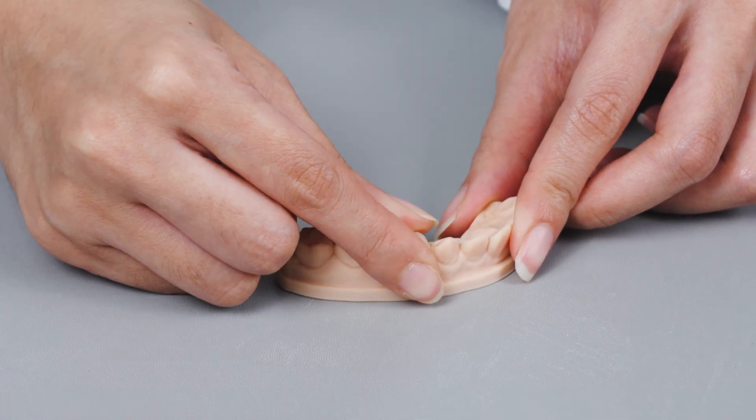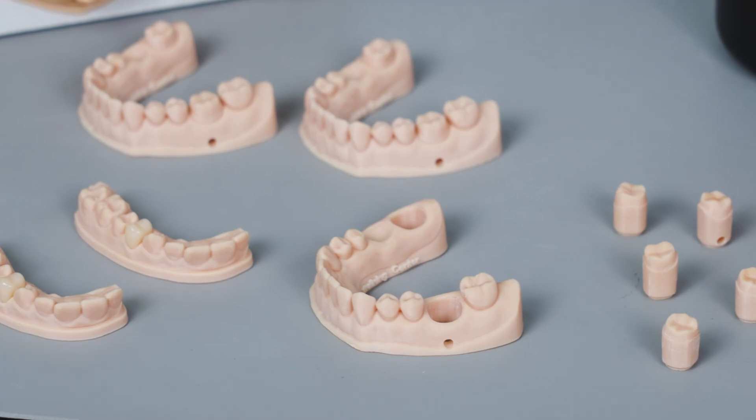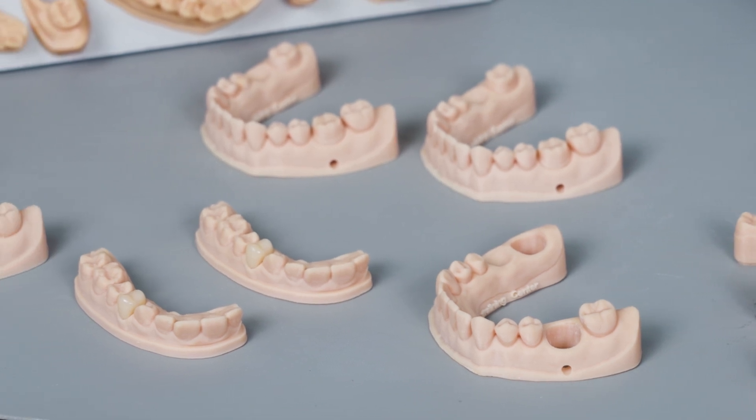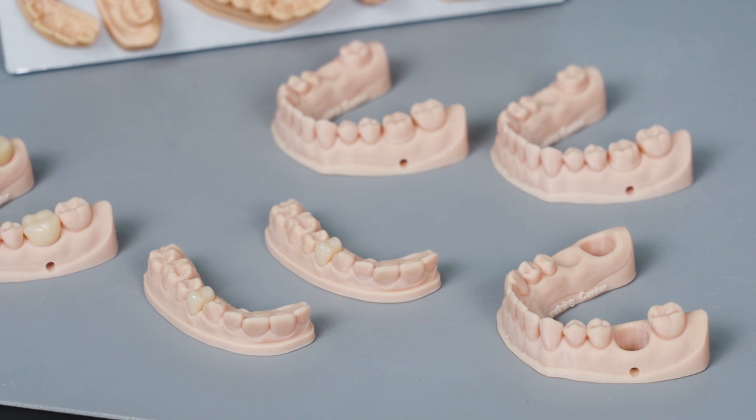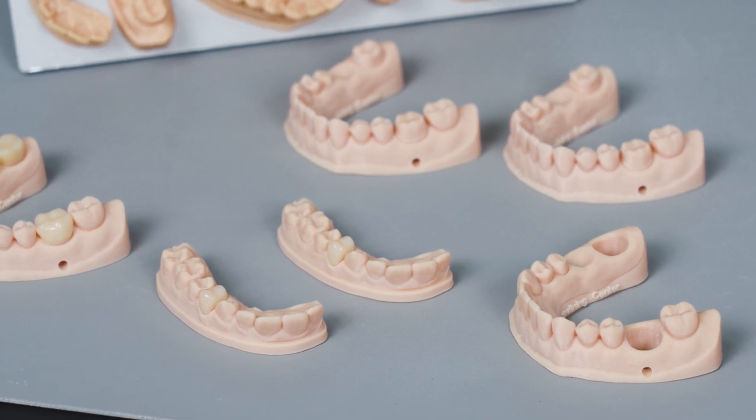If you would like to save time and cost for your clinic, this workflow is perfect for your needs. Meet your patient for the scan process in the morning and complete the crown in the afternoon. Would you like to improve your workflow with 3D printing? Check the links to see more details about Frozen Dental solutions.